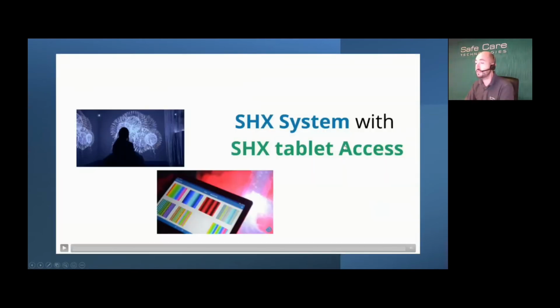And now what I'll do is I'll move on to the system. So with the system itself, and what you'll find basically with the projection, as we change it with our access method, you will see that all the pages would have the general 6 buttons, basically. So you'll see, like the button 6, you have 6 options. So I'll play the video so you'll see what I'm speaking about.